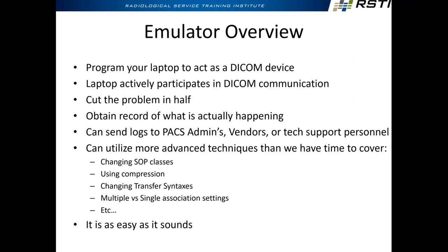You can try different modalities, CT, then 3D, tomo, start recording. You can try compression, no compression, little endian, big endian. You can change all of this stuff. The things that we were talking about here were just kind of basic setup, making sure it's working. And now when you're really troubleshooting, you can configure all that stuff and see what works, what doesn't work, check performance, that kind of thing. Very cool. Makes sense? Okay.